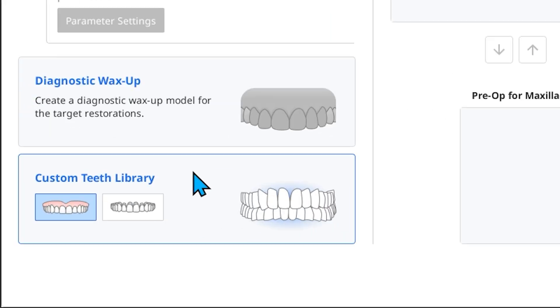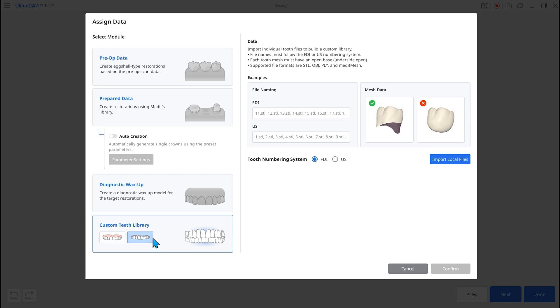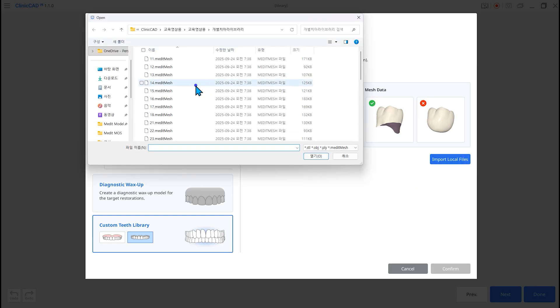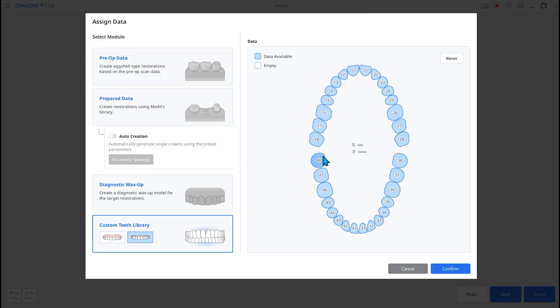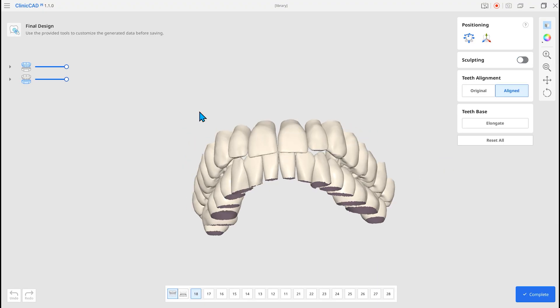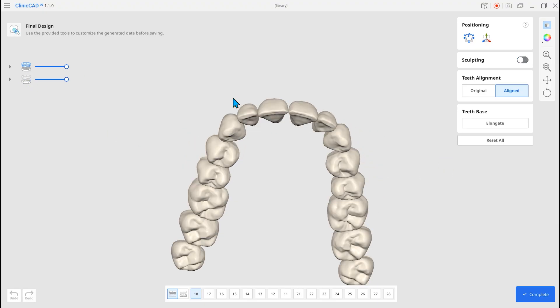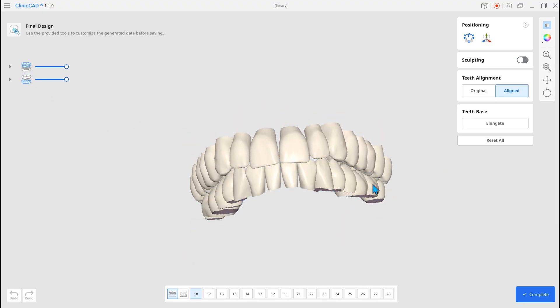In Custom Teeth Library, select from Individual Files to generate a library from individual tooth data. With the Custom Teeth Library, you can use scan arch data and individual tooth data as a Clinic CAD library.